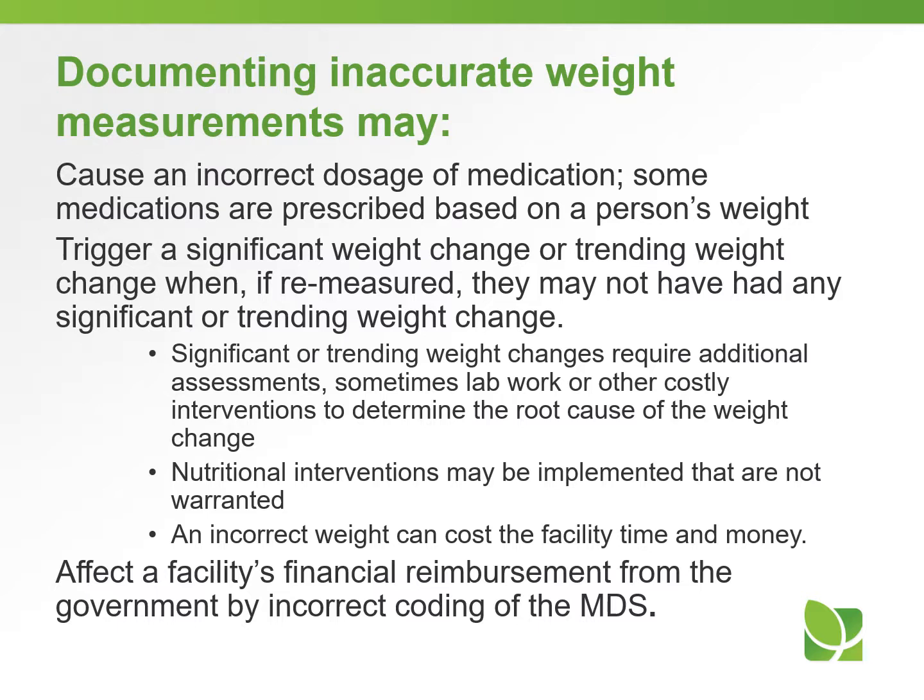Documenting inaccurate weight measurements may cause an inaccurate dosage of medication. Some medications are prescribed based on a person's weight, or trigger a significant weight change or trending weight change when, if remeasured, they may not have had any significant or trending weight change.